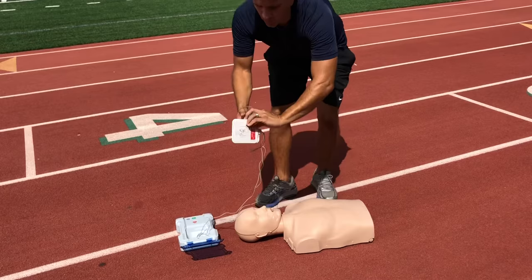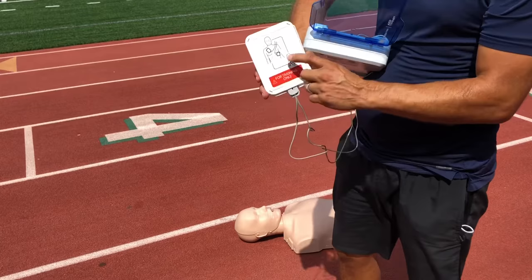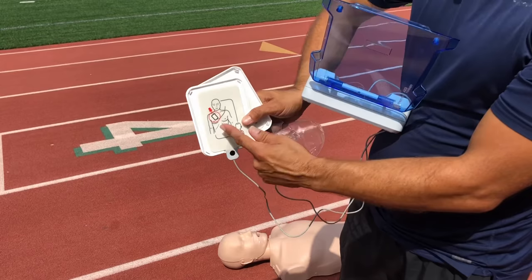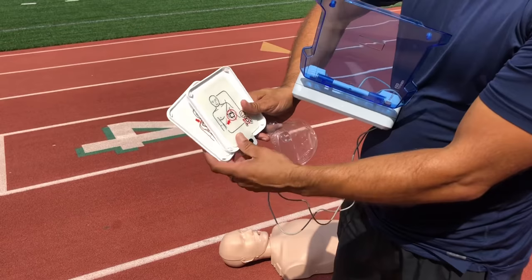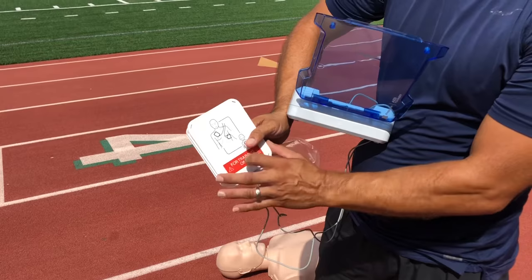Open the packet and apply the pads on the patient's bare skin. The pads will show you exactly where they need to be placed. One pad is placed diagonally above the right chest, just inferior to the right shoulder. The other pad should be on the left torso, beneath the pectoralis area, beneath the nipple line.